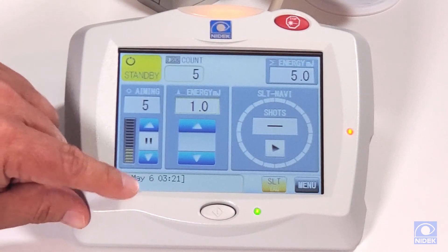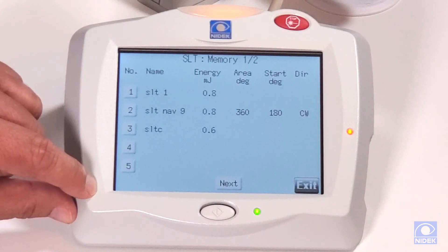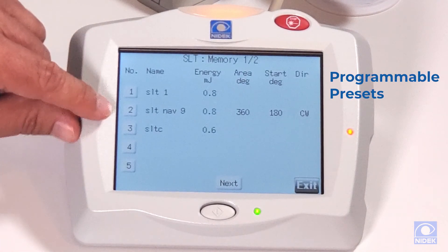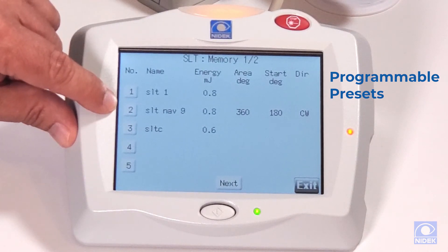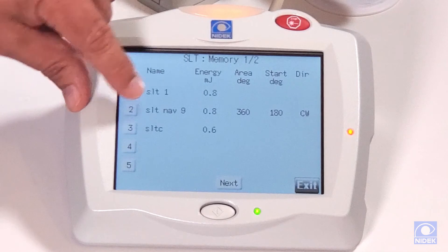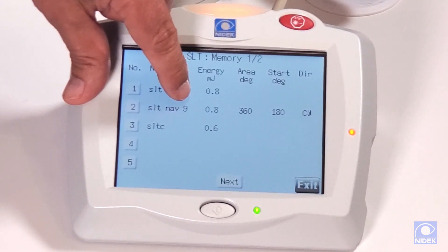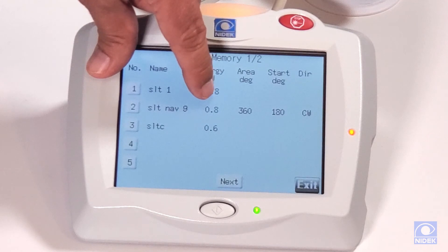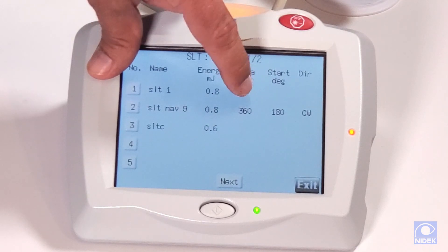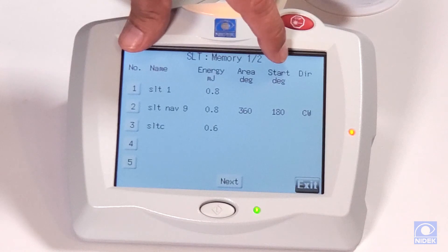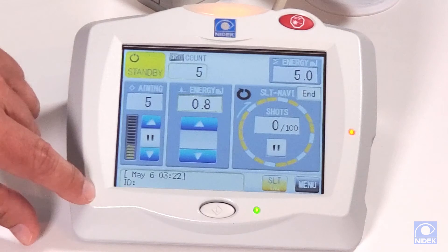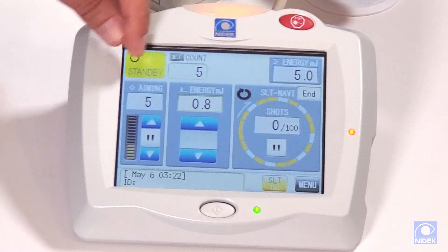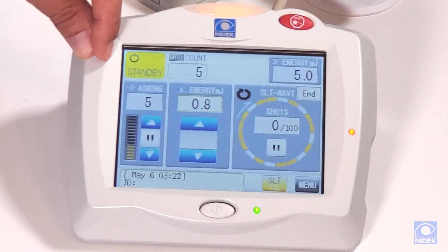In addition, we have a memory function in SLT mode where you can pre-program your favorites or each doctor's particular settings. For example, on preset number two I named it 'SLT Navi 9,' meaning I start at nine o'clock with an energy of 0.8 millijoules, area degree of 360 degrees, starting degree of 180, direction clockwise. Once I select preset two, it automatically loads those parameters, so I can treat patients efficiently and effectively.